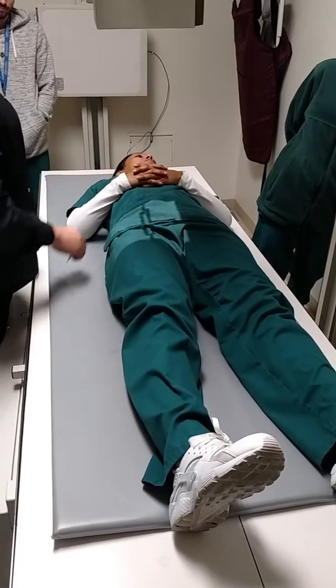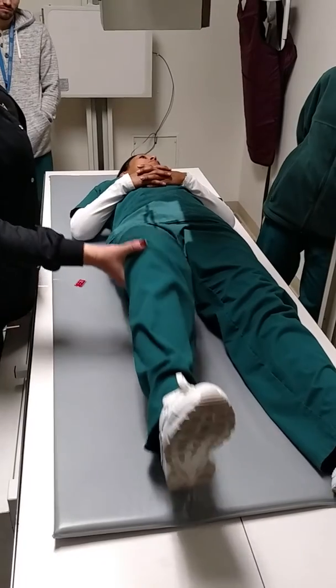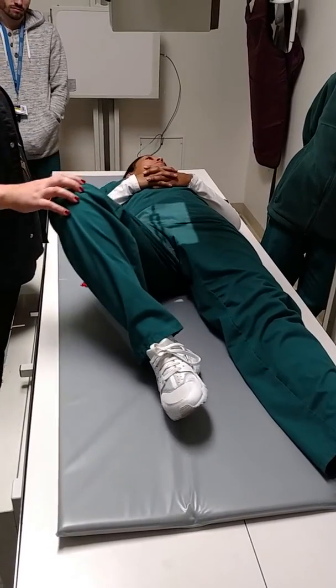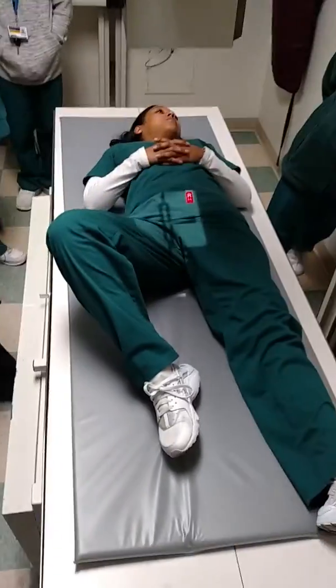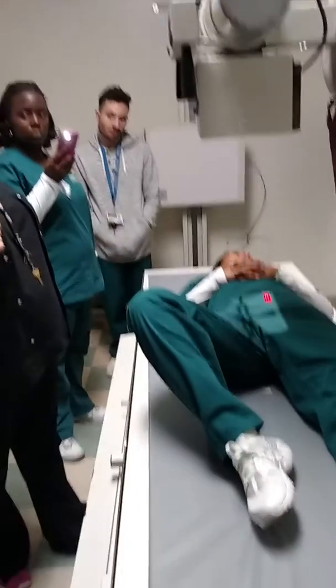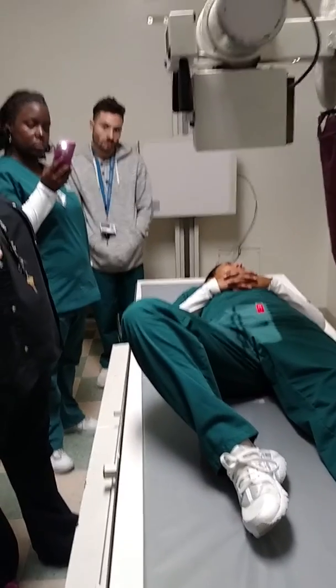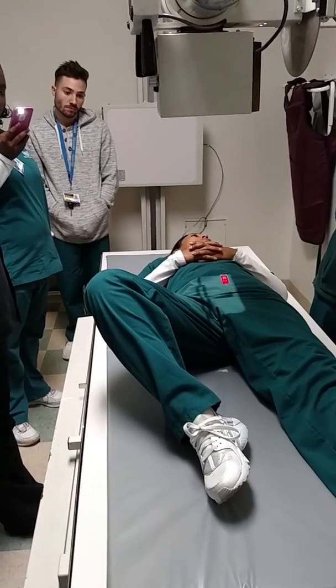Now we need a lateral hip, the central ray is in the exact same place, mid-femoral neck. So we're going to do a bend and then a 45-degree abduction for a frog. That's a lateral hip. It's called a lateral hip, it's called a frog leg, it's called a modified Cleaves. Three names for that one picture. Hold your breath, beep.